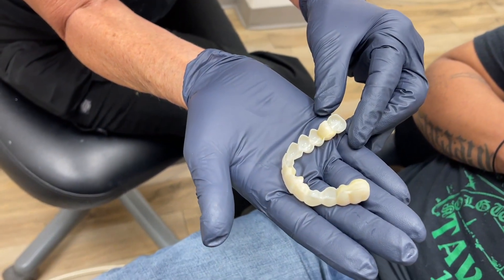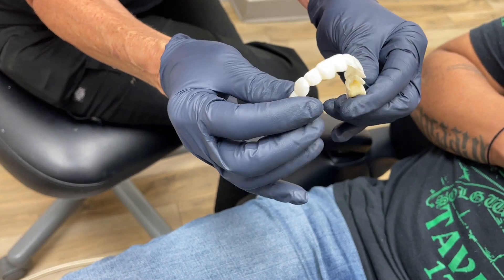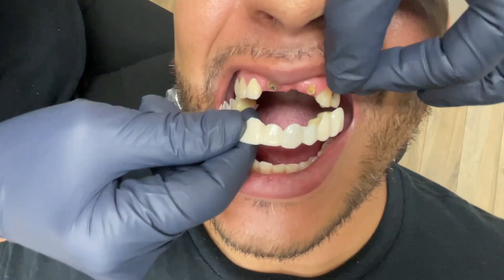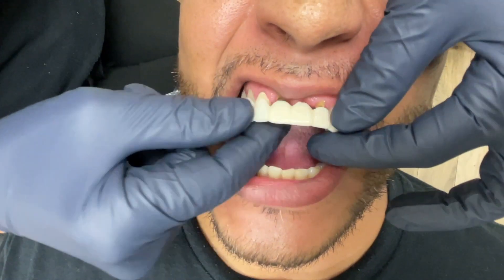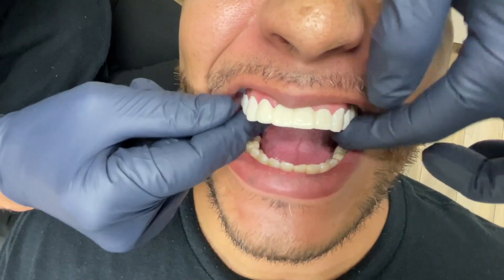So you can see this is the Snap-on Smile veneers they did. They might look a little bit okay, but they don't fit right. I'm going to show you what it looks like in his mouth. This is not our product, but we're going to place it in. He's missing teeth here. We retain these root tips because they're not decayed, so we did not need to take those out and he had no other decay. But this basically fits in, but it's very loose and it just doesn't look good.